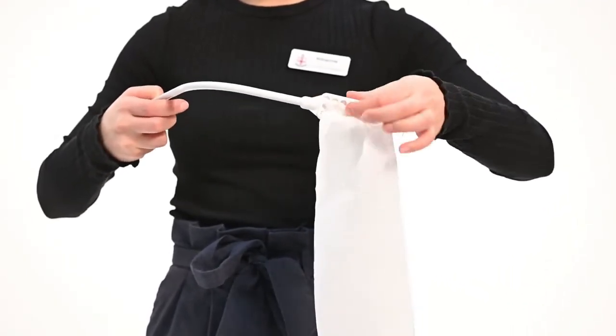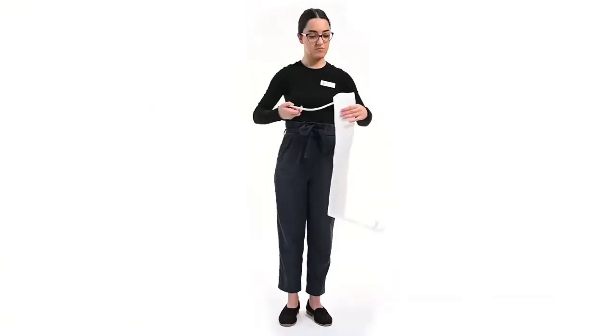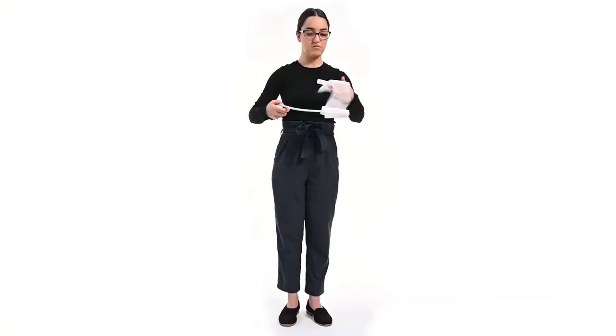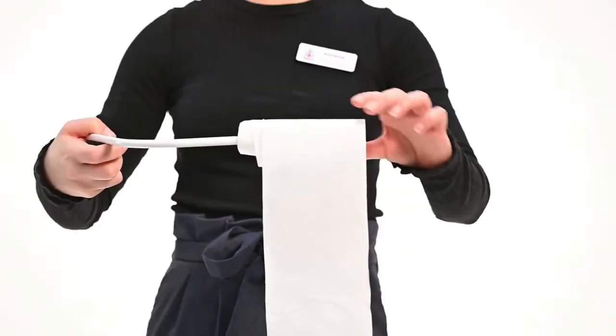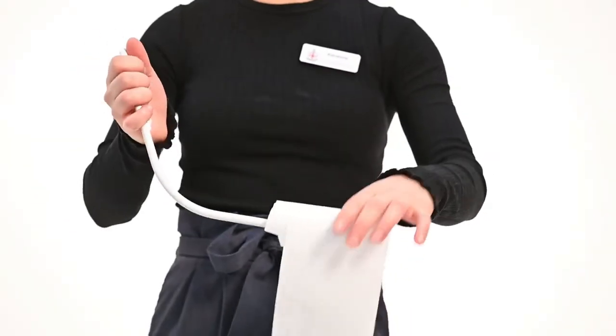Wrap the toilet paper around the triangular end. Then you are ready to wipe, either reaching behind or through the front if that is more achievable.